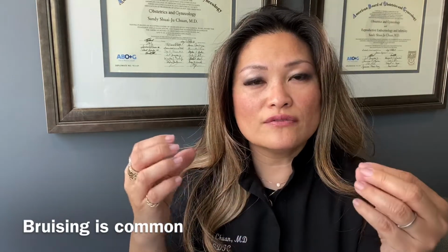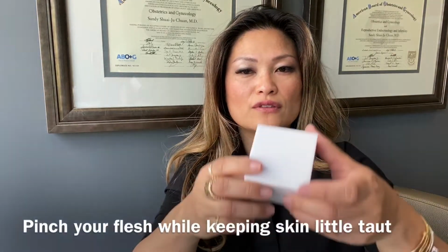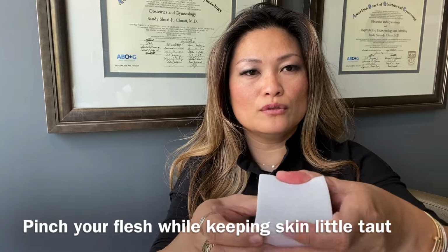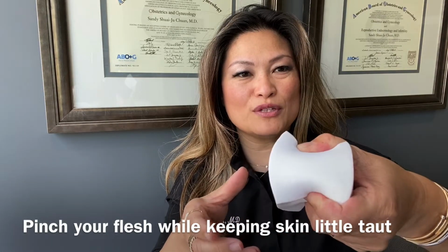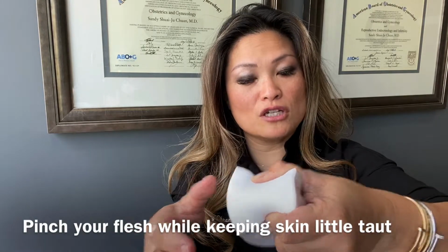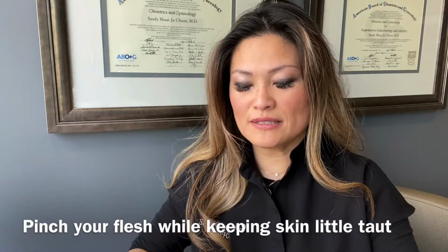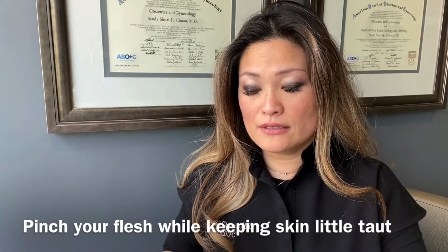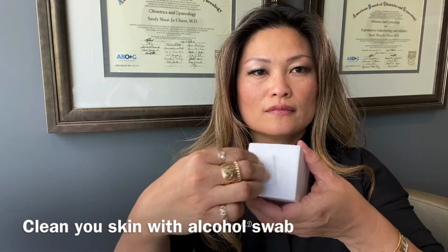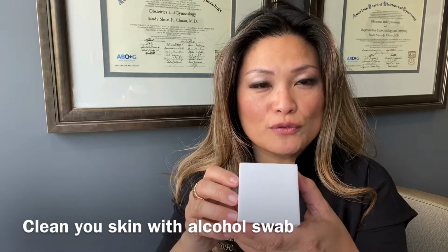So definitely identify that area, and then you want to pinch it. Let's say this was your abdomen, you can pull the skin back. It's a little hard with this, but you want to pinch it like this, okay? So that it's a little taut, and you're making a little pinch of a roll almost. And with that, you want to clean it with an alcohol swab, like I said, before you inject.